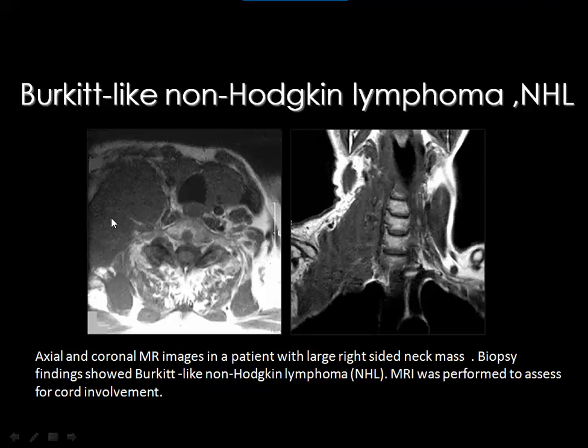You remember, or you should remember, that the best way to characterize neck masses that do not show typical imaging criteria is to go by fine needle aspiration guided by ultrasound. And this is one of the basic techniques now routinely performed for sampling lymph nodes to assess the possibility of metastatic disease and to sample any lesion which is not showing classic criteria as those I have mentioned.